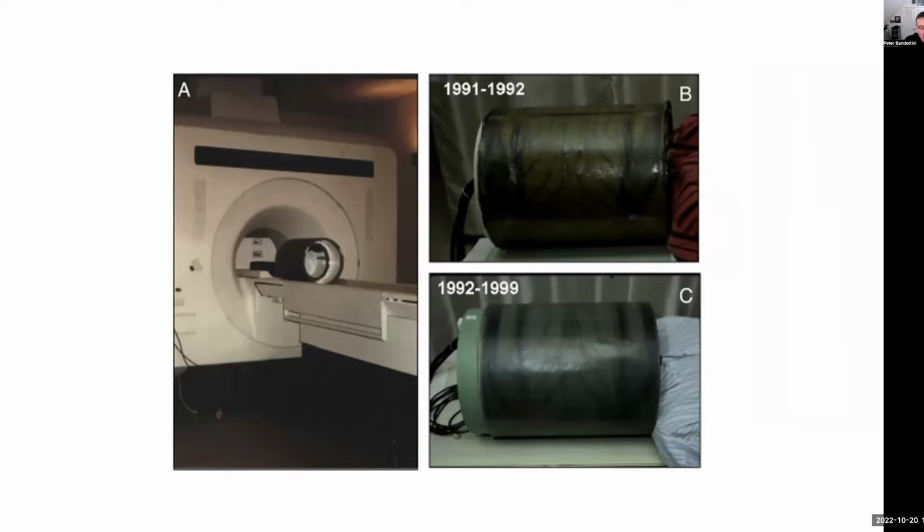Back at the Medical College of Wisconsin, we actually just used the standard 1.5 Tesla scanner. We used a local head gradient coil, and it had low inductance, so it was able to use the standard gradient amplifiers to drive it a little bit faster. And we had different versions of this.